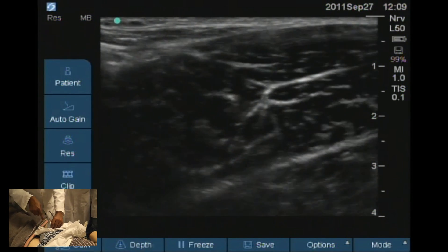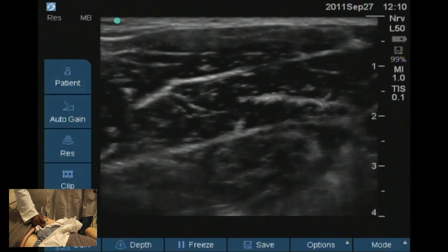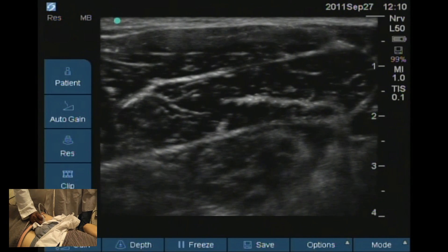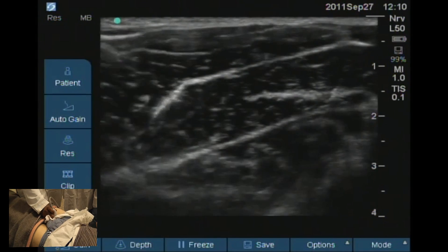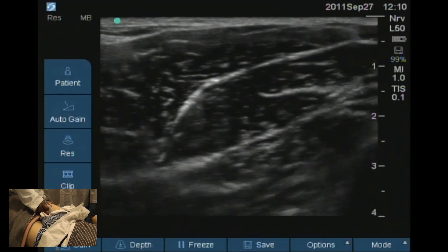With the out-of-plane approach, you pull the probe and travel less through the muscle — you insert it here. You go for a pop once you enter that space, put a bit of local anesthetic. Or you go in further, put a bit of local anesthetic, withdraw the needle, then put a bit more. So you're putting it in two different planes — it's a bit like the TAP block we put between two planes.